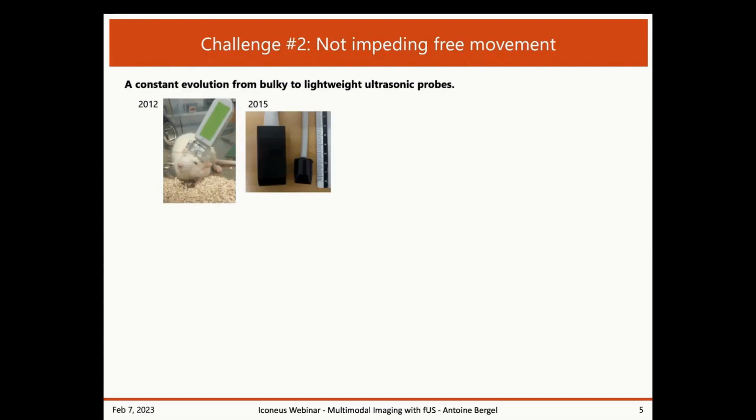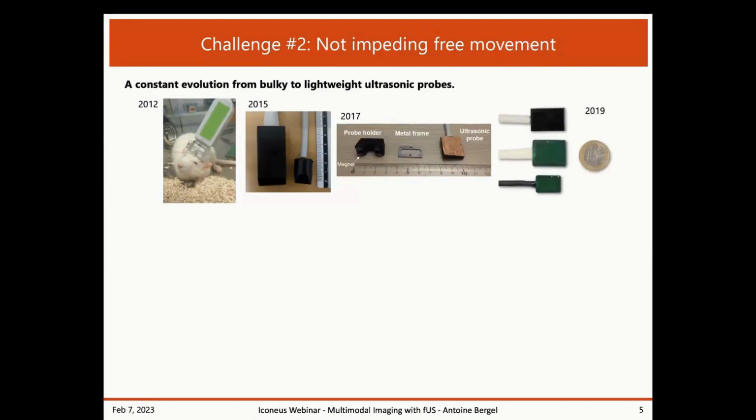In 2015, there was a first big revolution. We were using these second generation probes. Then 2017 came and we were able to change the holder. And finally, in 2019, we really have this miniaturized probe that allows some applications to be done on awake mice.